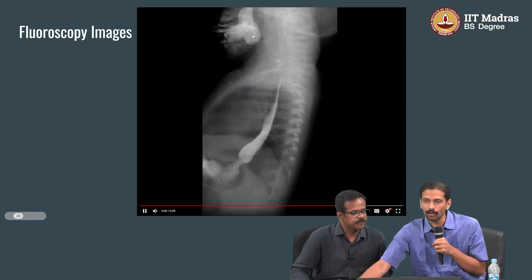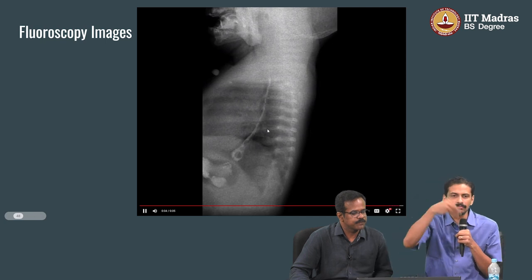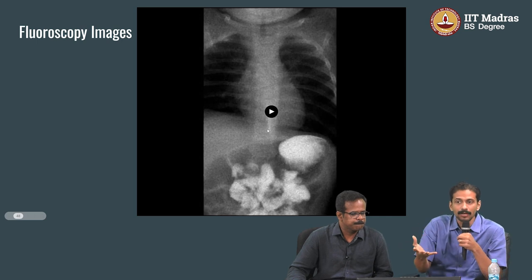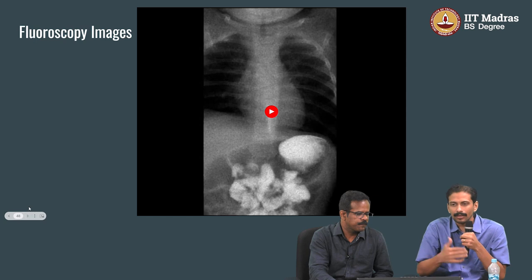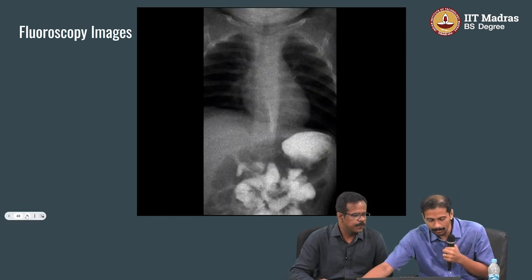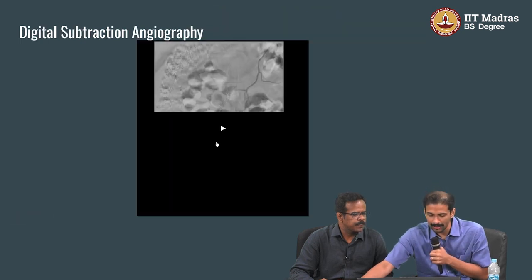And the child is swallowing the food which is given, and you can see the esophagus taking it in and pushing it into the stomach. So if there is any abnormality, it's very difficult to see it on simple radiographs. That's how these video X-rays are more beneficial.